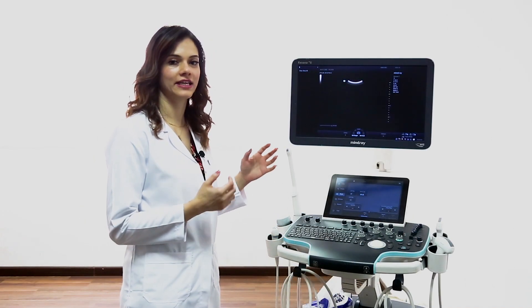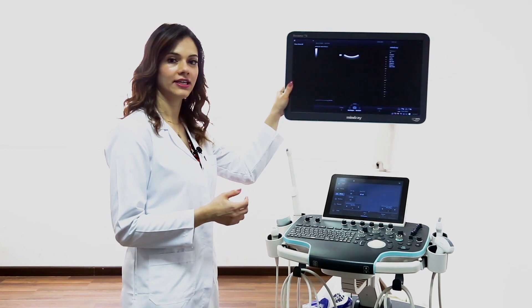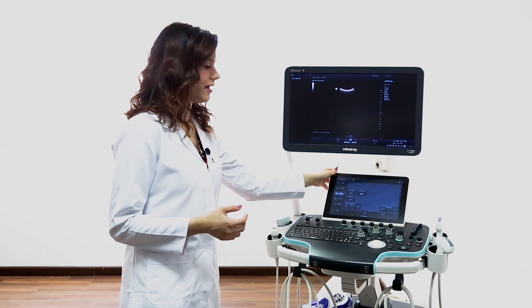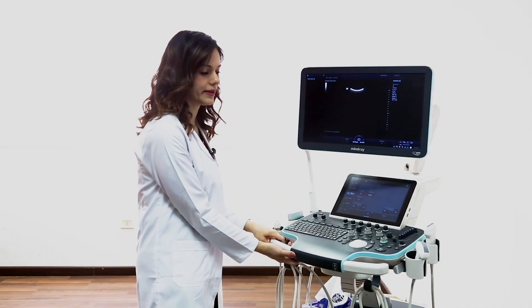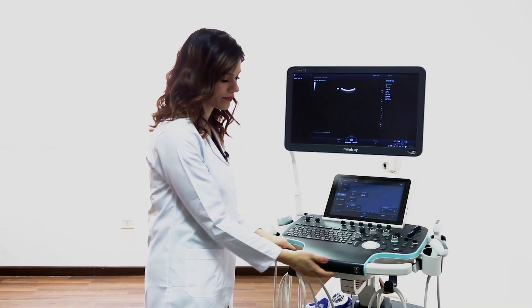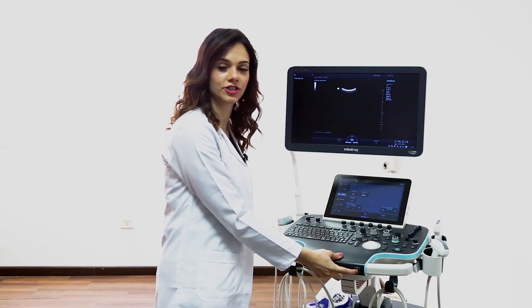Reson 7 comes with a lot of external features: a six-way direction articulating movable touch screen and an adjustable control panel in six directions, also with electronic height adjustment.